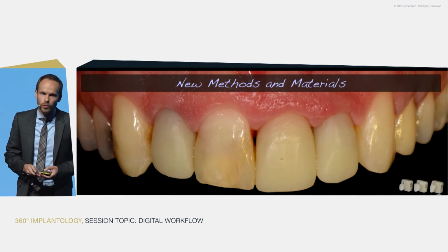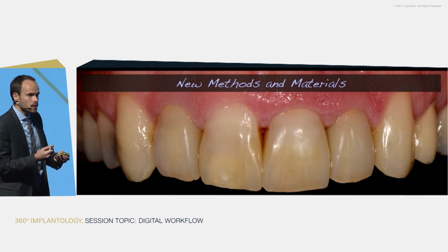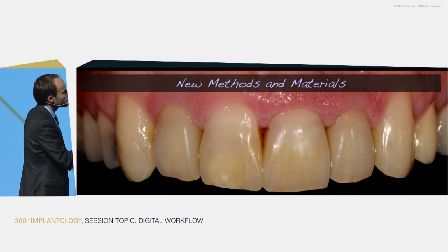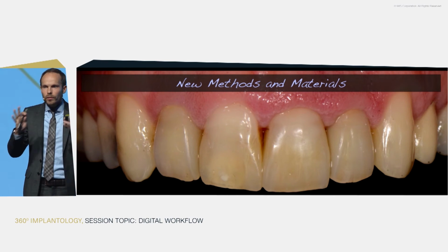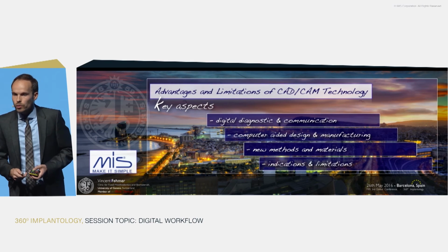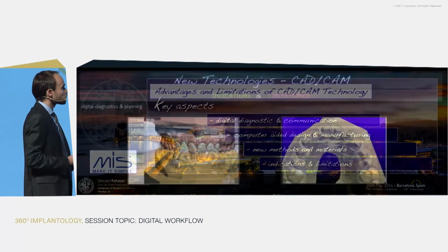So for the anterior zone, absolutely yes. We need the technician's work, we need all the skills, we need the layering technique, and we need some kind of aesthetic layering in order to achieve this kind of aesthetic and this kind of result that our patient wants and wants to take home with them.